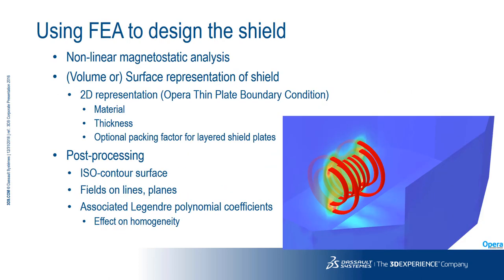Today we're looking at finite element analysis in the design process and in particular our software Opera. If we're looking at the design of the base DC magnet or the shielding for it, then we need to use a magnetostatic solver with non-linear capabilities. In the case of Opera, this uses just one degree of freedom per node, which makes it as efficient as possible in terms of both memory usage and solution speed.